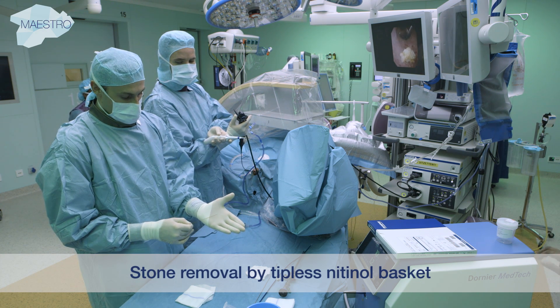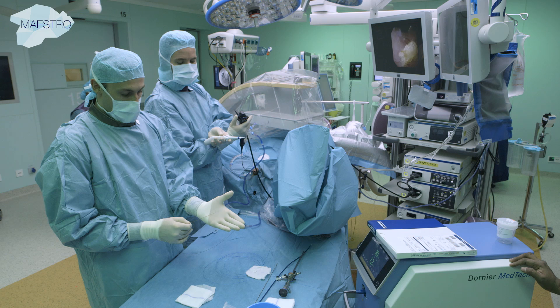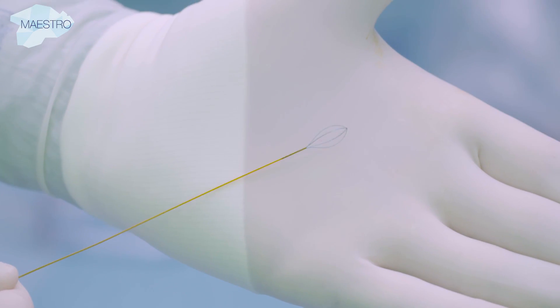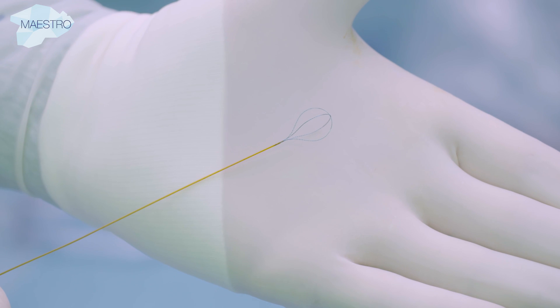We use a tipless nitinol basket to retrieve some fragments for stone analysis. The most standardized basket is a 1.8 French 4-wire no-tip nitinol basket.